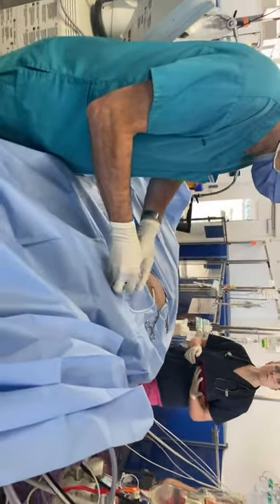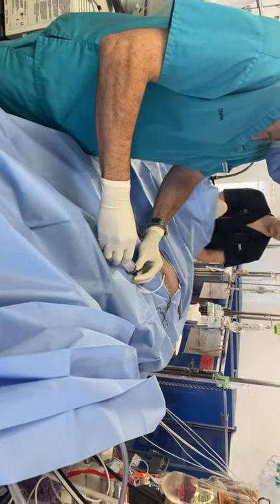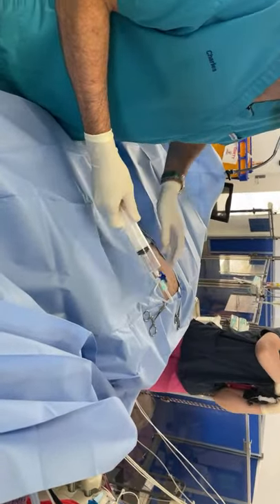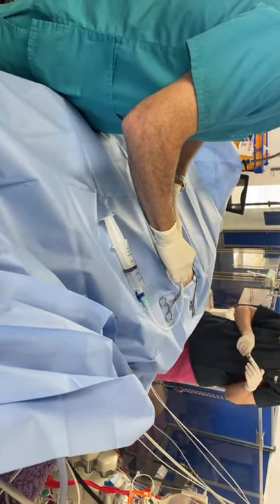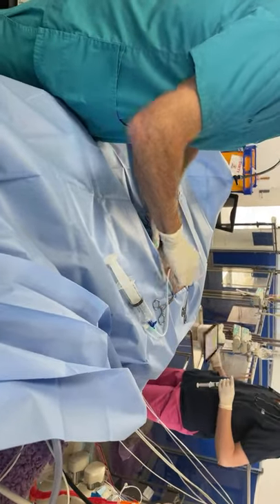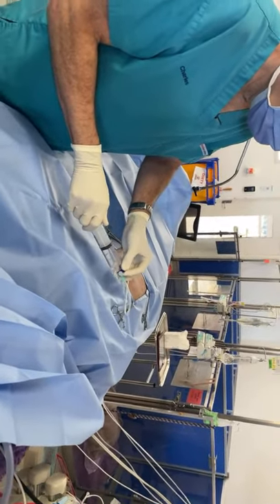I'm attaching the three-way stopcock and syringe, opening it up — making sure it's not kinked. I'm getting some air out now, though not as much as I'd expected. Unless Lorna drained it all — she got probably a liter and a half.